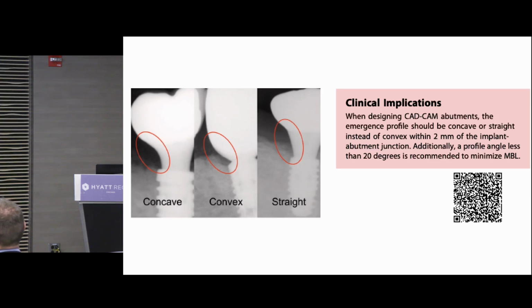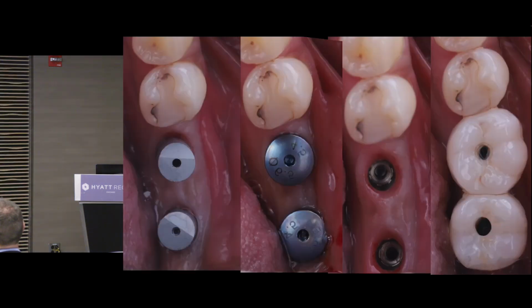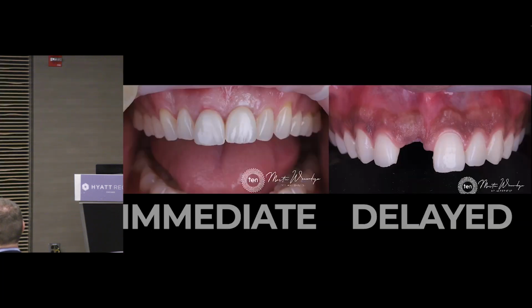And also the angle and shape of that abutment is really, really important. You can see there are 3 different profiles that it goes through. So this is me when Steve sends the crowns back to me. You can see how he's managed the thickness of the zirconia in critical areas, and how those have been bonded nicely. And again, it's a very straightforward workflow. Patient comes in, healing abutments off, and from there we fit the crown. What I want is a stress and hassle-free day, and that has provided it for me.